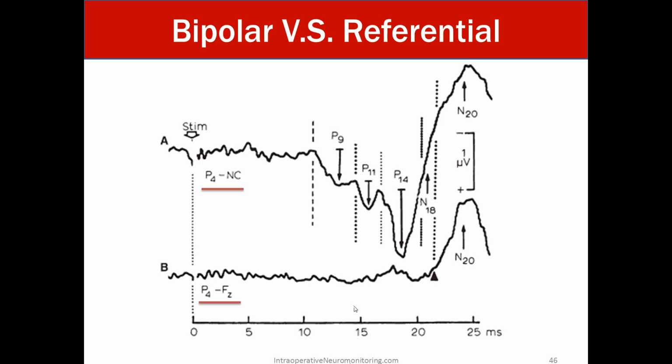We would need a cervical response. So if we had our N13 right here, we could compare the time between the peak of the N13 and N20. If that central conduction time was outside of normal limits, so we have an N13 going to N20, 7 milliseconds is probably the normal limit. If it was 13, then we might have some kind of demyelination or problem in the cervical area to the cortical area, and that's all we could tell from that.